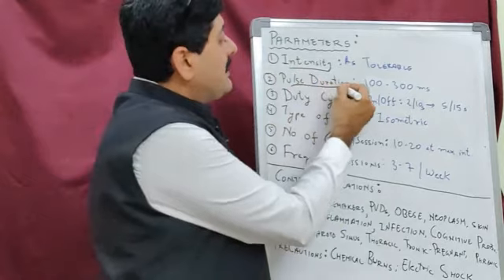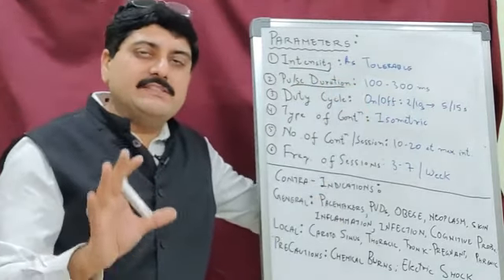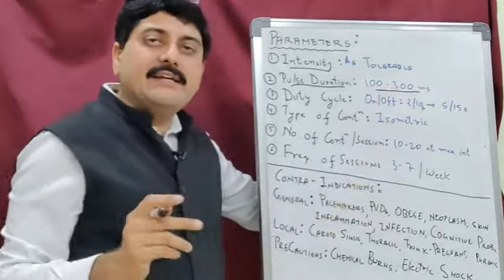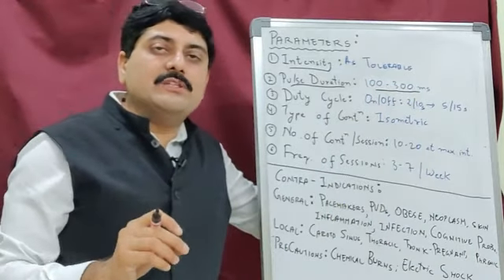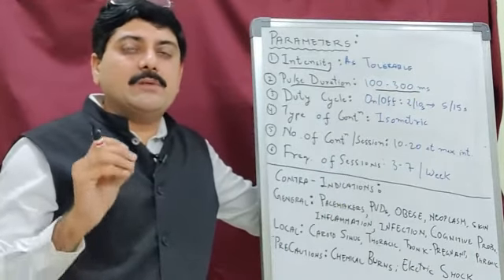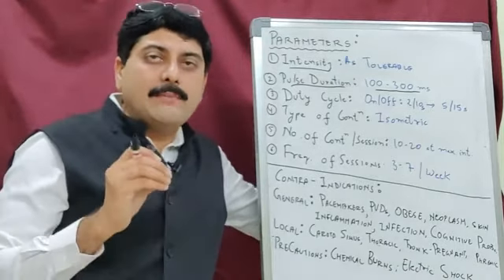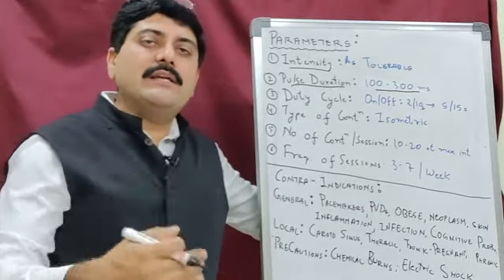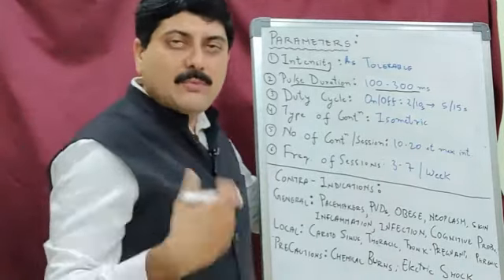Pulse duration, as we had already discussed, we start with the maximum pulse duration, that is either the 100 or 300 millisecond intermittent galvanic, so that it is comfortable and uses minimum intensities. So the patient is not intimidated and doesn't get fearful about electrical stimulation. And we start with a lower current and gradually increase the current as the patient starts getting accommodated to the current.